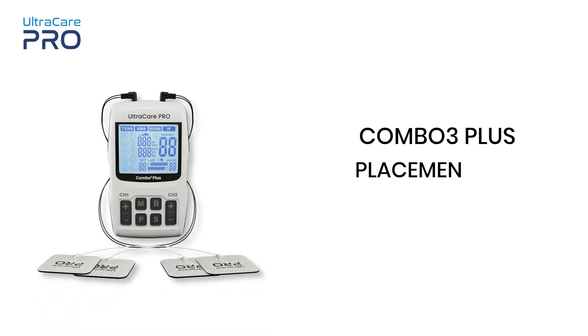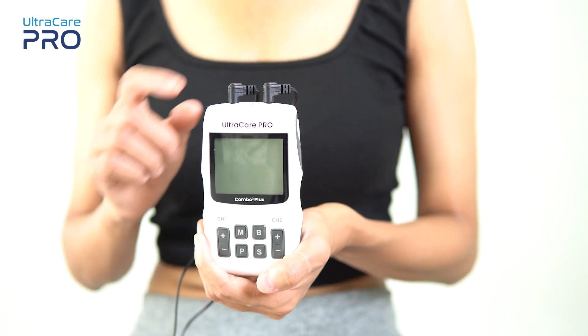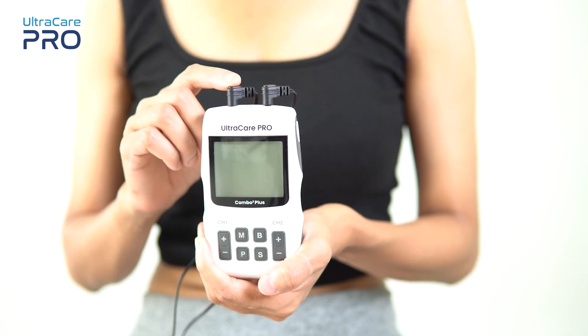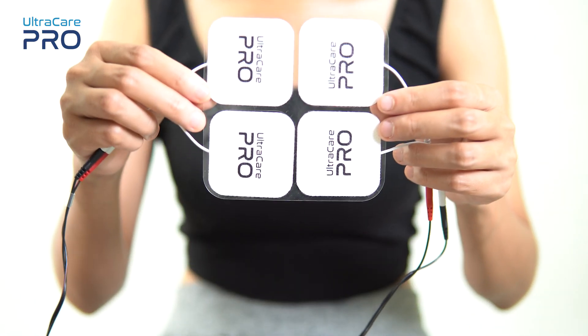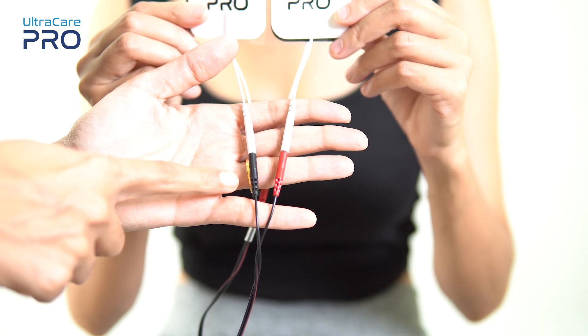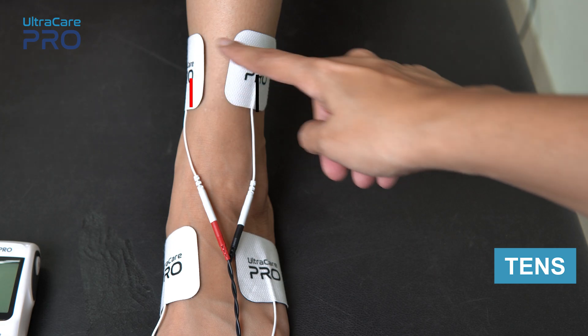In this video we are going to have a look at the electrode placement of the Combo 3 Plus device by Ultra Care Pro. Wires attached to the electrodes come from channel 1 and channel 2 of this device. Each channel supplies current to two electrodes — one of red color and another of black color.